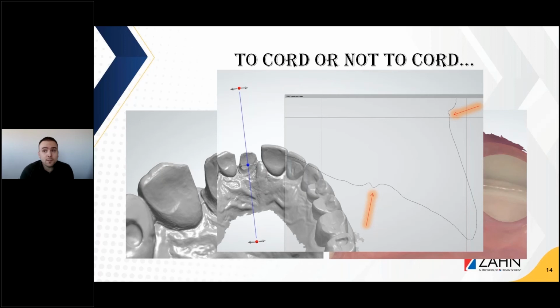So maybe during these times where they're not seeing as many patients and remakes are costly for them quite a bit, maybe they'd be willing to have that conversation again with you to see how they can improve their intraoral scans. So that's one of the main ways that we see that they can be improved.